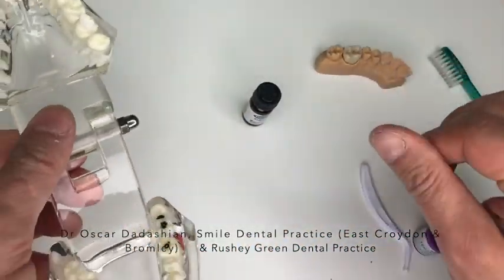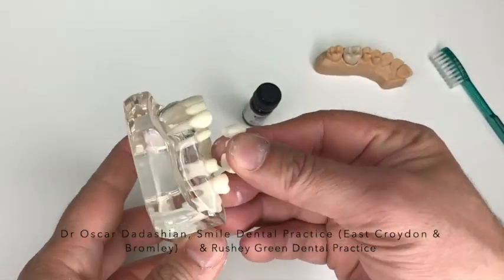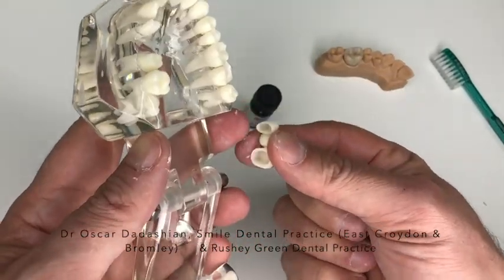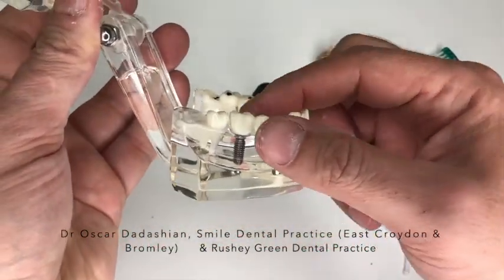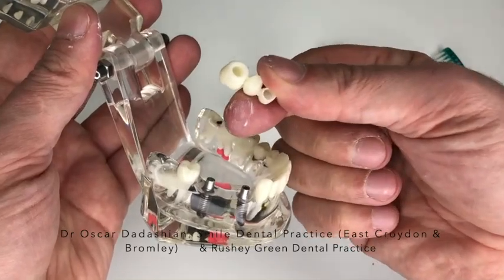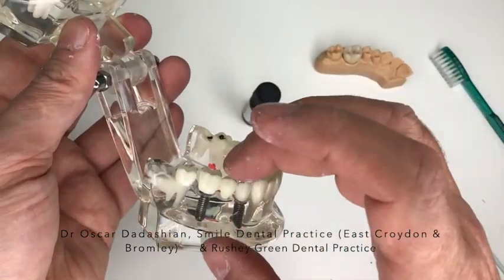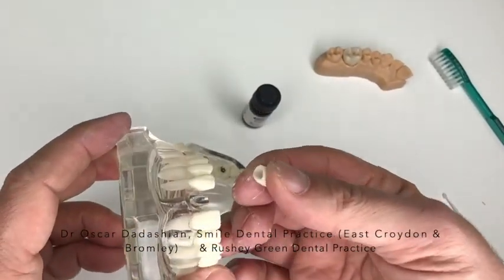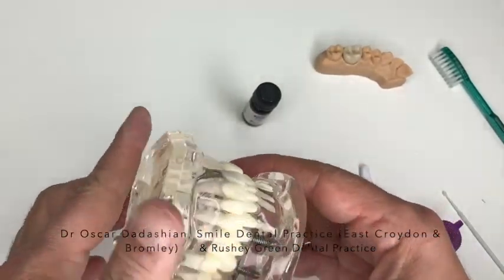You can do exactly the same thing if it is a bridge that has come out. You do the same thing, you clean the adjacent teeth, you fill this up and you put it back in. If it's a bridge on implants, same thing there. You clean everything up inside here and on the abutments, put a little bit of material in there and bite together. And same thing if it's a single crown on an implant, you do exactly the same sort of thing to put it back in.